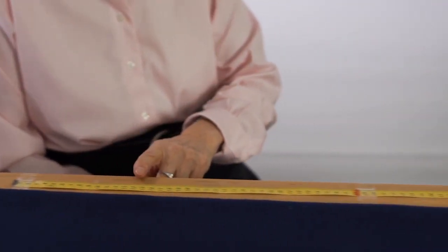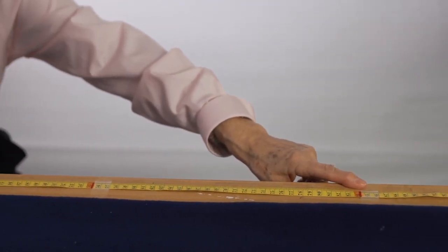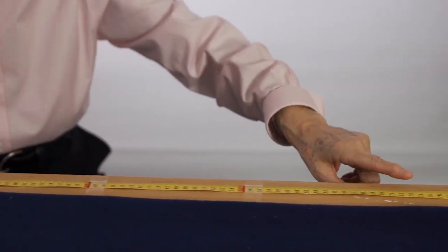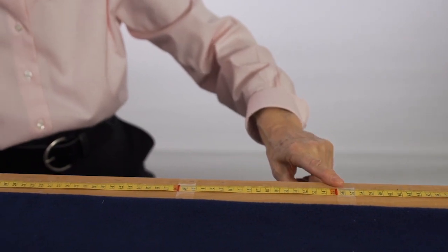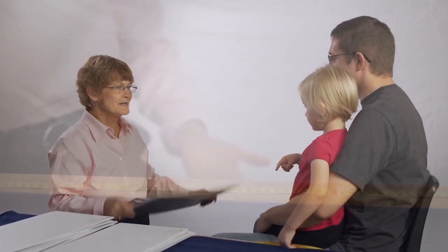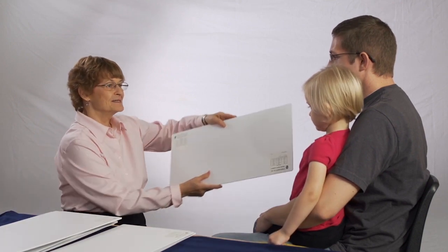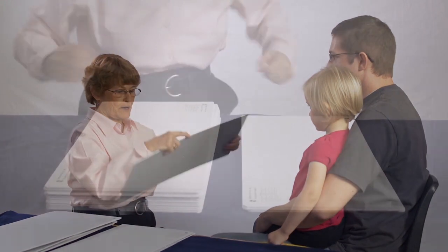This needs to be measured before testing. For 84 centimeter distance, used with older children, a measuring tape is needed. Alternatively, a measuring tape can be placed on a table surface adjacent to the patient and the examiner with marks for each distance. The examiner should check the test distance periodically during the testing, as some patients will lean forward to get closer to the gratings, especially when they become finer and more difficult to see.